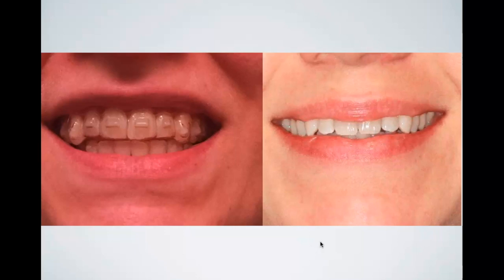So like traditional clear aligner therapy, you have a suck down, right? So you're limited in force by the anatomy of the teeth, by the suck down, where that's placed on the machine, depending on if you're doing them in-house versus sending them out, the thickness of the material, how long the tooth is, how deep the undercuts are. So for instance, when you do a suck down on a model, if there's a deep undercut, that area of aligner material is going to be thinner than other areas that don't have to stretch so much, if that makes sense. And so there's a lot of variability even in just anatomy, and that's one of the reasons why it's so challenging to predictably finish aligner cases with one system without any customization.